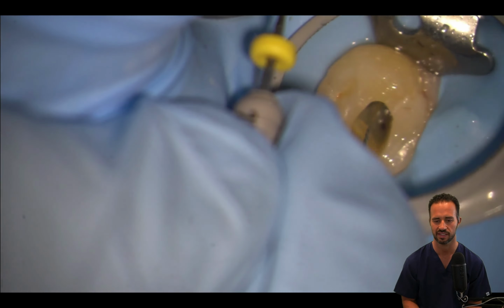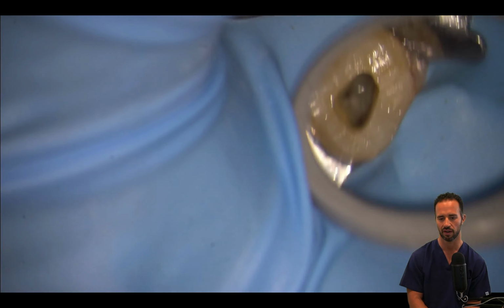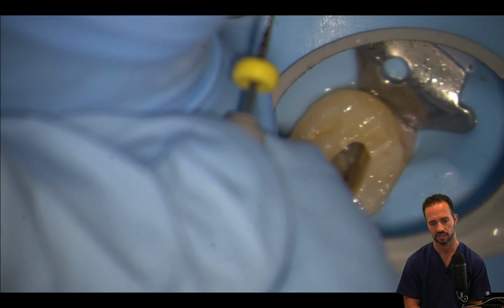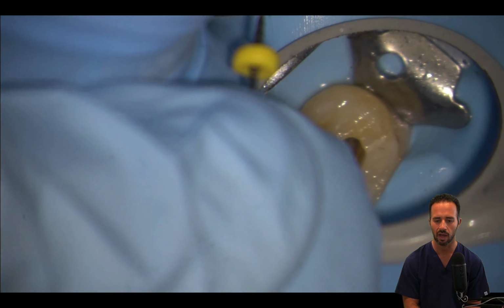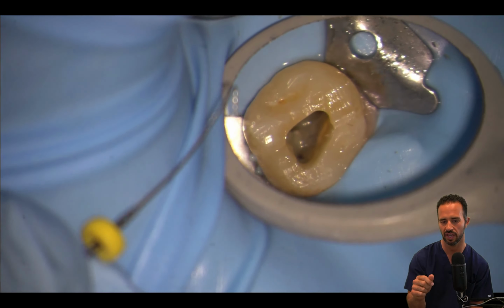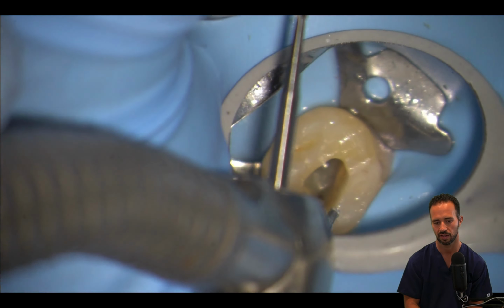So I've got an 8 hand file and I'm trying to see if I can snake it into any MB2 crevices, and we're not getting anywhere. It's a solid block of dentin. So I'm trying again with another 8 file. This is a C file, and still we're not getting anywhere. It does not want to progress. There might be a little bit of dentin still over where the MB2 should be, where your orifice opener and your hand file might be trying to get into, but in this case, it's a solid block of dentin.